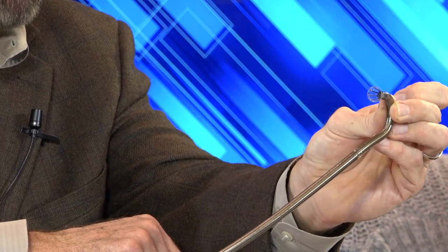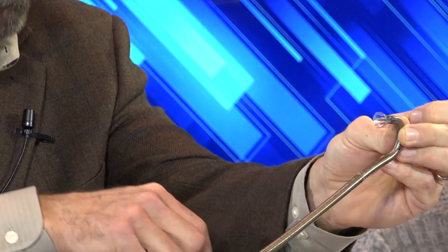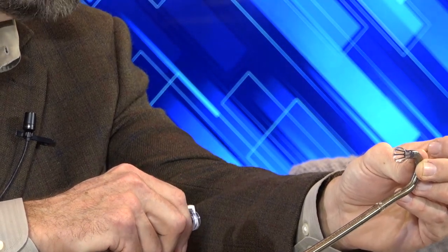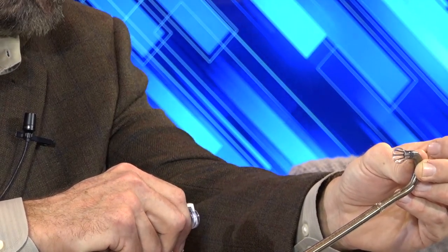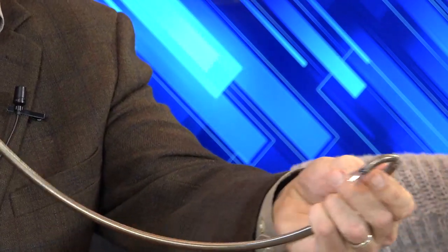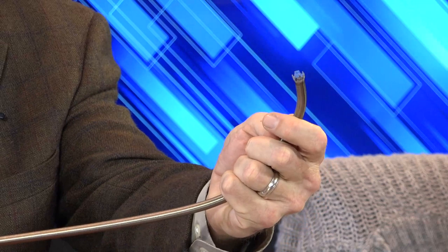And for people unfamiliar with nitinol, when it gets warm, it expands. So as that's collapsed in the cool, you put it through the sheath, it gets in the bloodstream, and it opens up. And so the way that it's done here, instead of a balloon to expand our funnel, we actually have an oversleeve. So you'll actually retract the funnel into the oversleeve.